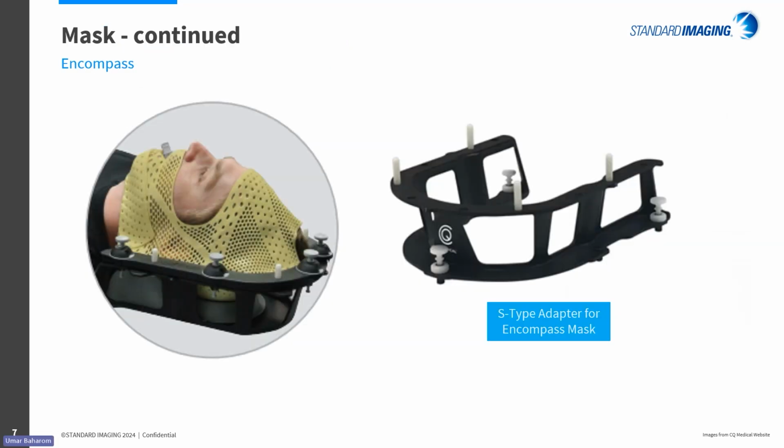If you are familiar with the Encompass system by CQ Medical, we can support this as well. We don't directly support it where we have a mask interface for it, but CQ Medical does provide or sell an S-type adapter for the Encompass mask. So this is something additional you would need to purchase, but it will fit on our S-type TruPose system.